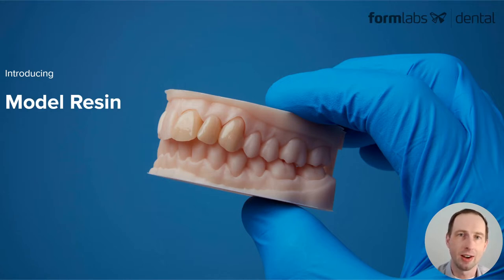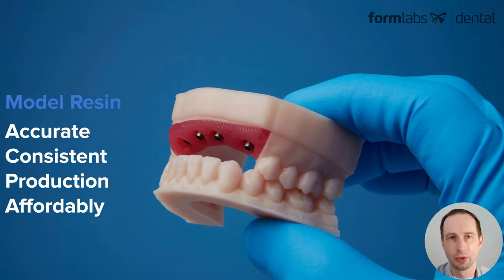Model resin and our SLA printers create an ecosystem for producing high quality restorative dental models, and specifically fixed models that are accurate, consistent, that have the production requirements that laboratories and high volume producers require, and it's done affordably.